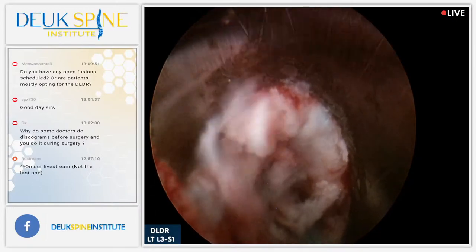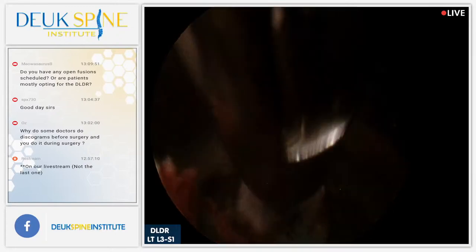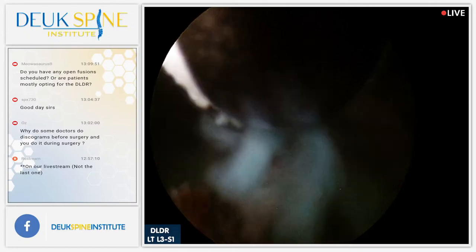Henry, I almost thought we were getting up for another good inflammatory picture, but I think most of that's just blood. All right, I'm going to grab some herniated fragments out.